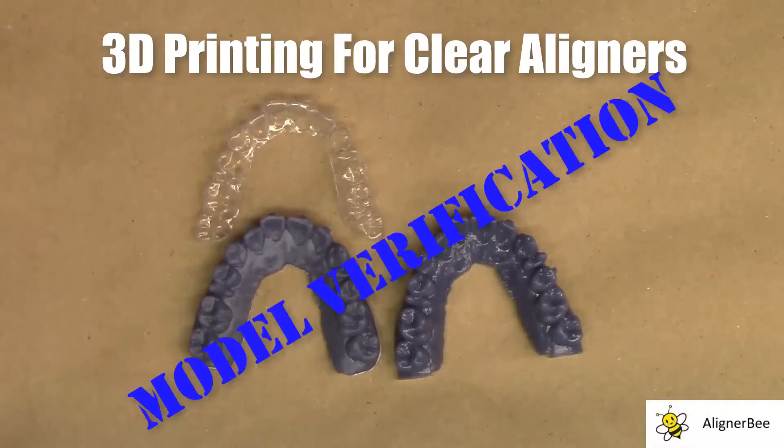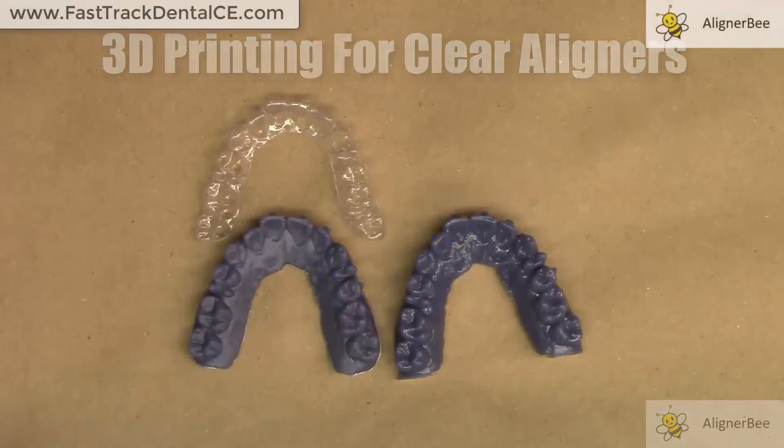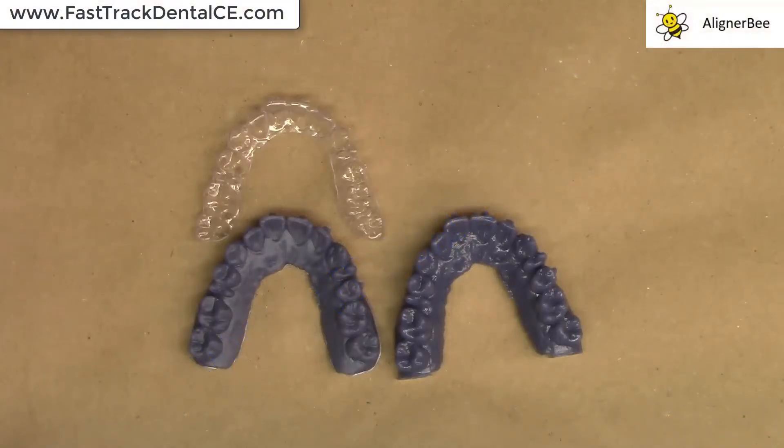This is Dr. Melissa Chotel, and today we're going to take a look at two models that I've printed on my SprintRay Pro 3D printer. This is a patient case that I am treating with clear aligner therapy, and this patient is currently at step number 15 in their aligner progress.